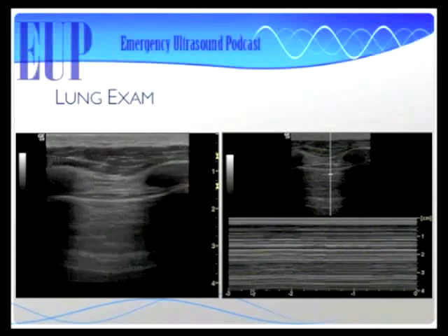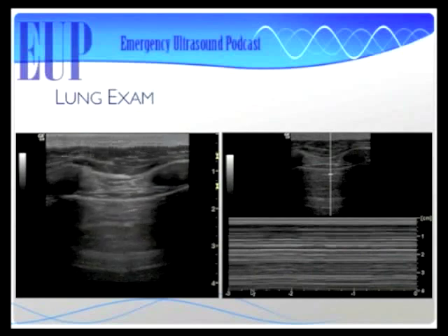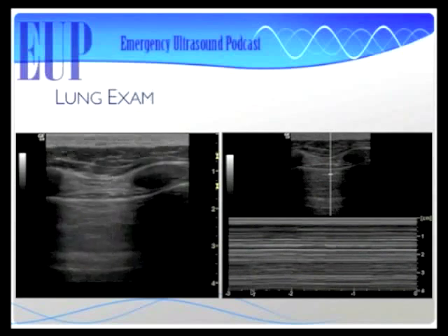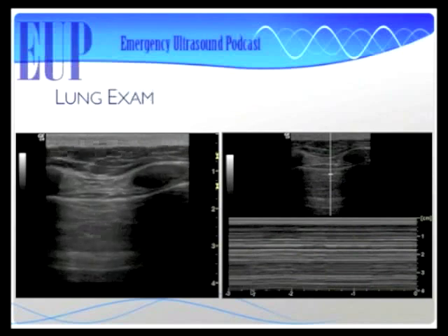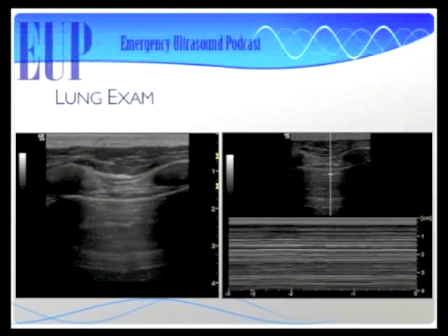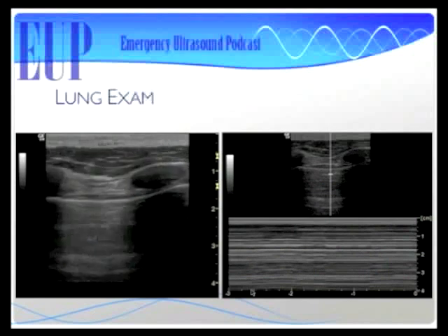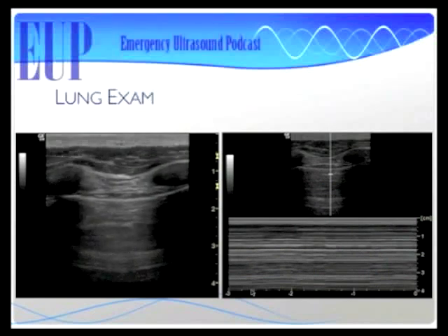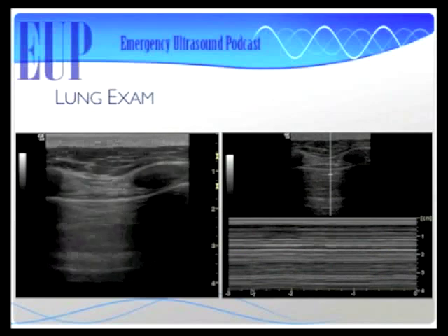You get that because the ultrasound can't really see past the lung anyway. So everything you see past the lung is typically artifact. And if the pleural lines are sliding on one another, then you get that sandy appearance because it can actually see the two pleura sliding on one another. Whereas if there's not visceral pleura touching parietal pleura, then it hits that pleural line and can't go through the air, so it just bounces right back at you. So you basically get the same thing repeated over and over again, which is why you get the stratosphere sign.